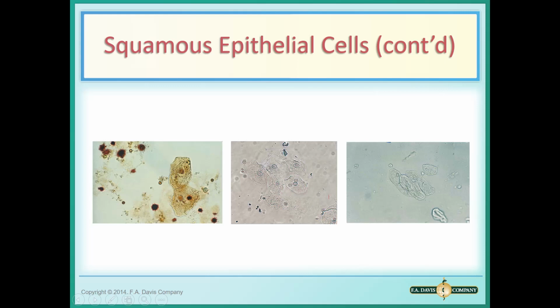I didn't look to see if the picture itself was a stained one or if it was hemoglobin stained. I should have looked. Just flip into the book. Do I see the definition? Yep, this one was stained within the laboratory. But large ones like this.